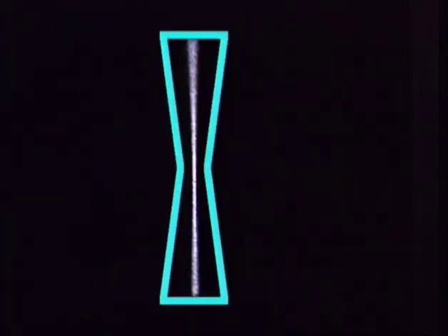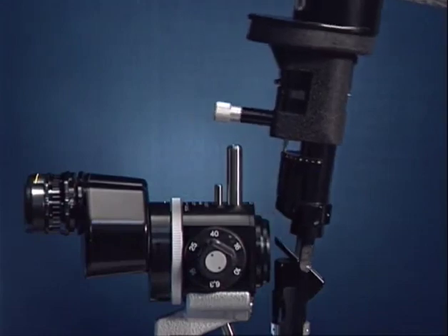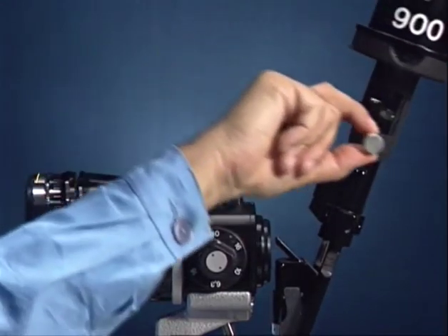When tilting the unit, the width of the narrow slit light becomes unequal and the quality of the optical section is reduced. With a tilted illumination unit, a perfect optical section exists only when the slit is rotated horizontally. Therefore, tilting the unit requires a change of the slit orientation to horizontal.